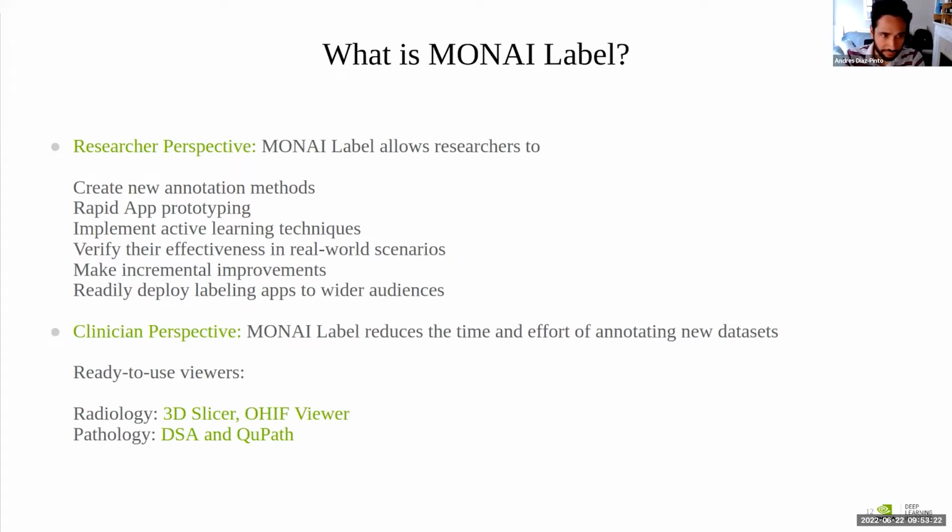And of course, for the pathology, I haven't mentioned a lot, but we also have the Digital Slide Archive and the QuPath user interfaces that either the pathologists or the researchers on pathology applications, if they want to build on top of that, they can also use those applications or those user interfaces to work with.